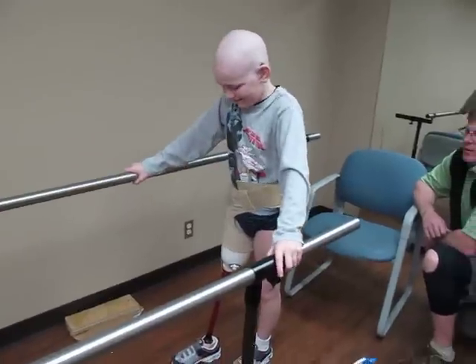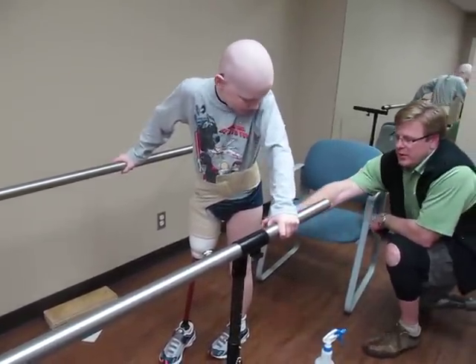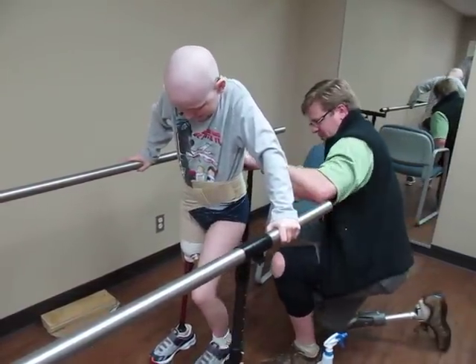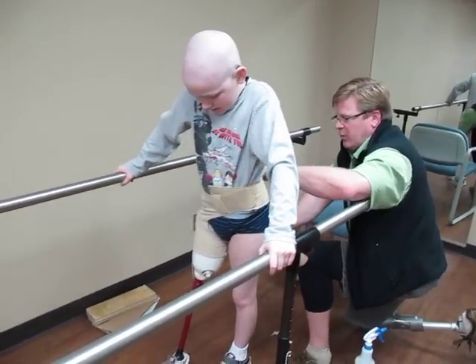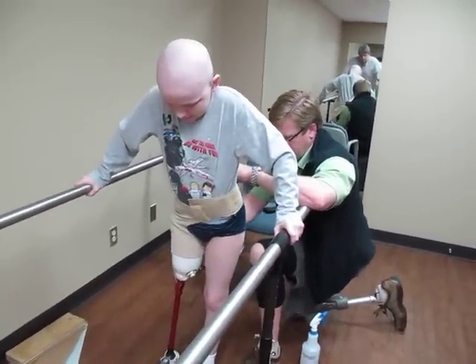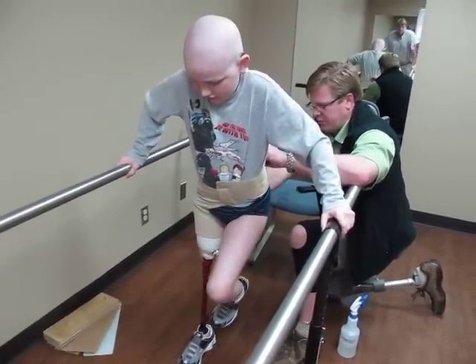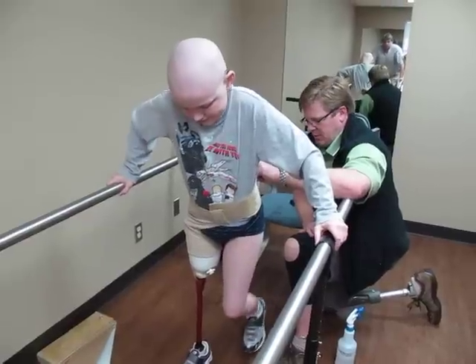Can you do me a favor? Can you try to take your weight off of this leg and hold your arms up and kind of put weight on just that one prosthetic side? Just find your prosthetic side. Just put all your weight on it, on this side. No, no, don't lock — I just want you to stand there and get some balance. Just take this leg off. I'm trying to get that one down straight. Okay, good. Perfect. Good job. Now just lift this leg up and hold, just support yourself right there. How's that feel? Good. Well, that's a great word.